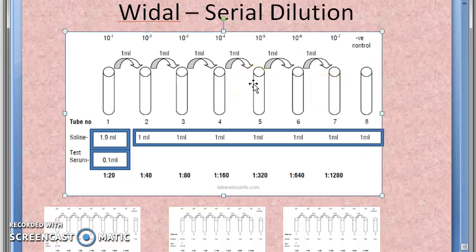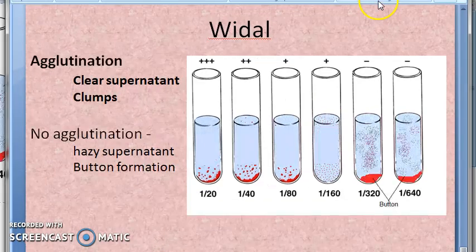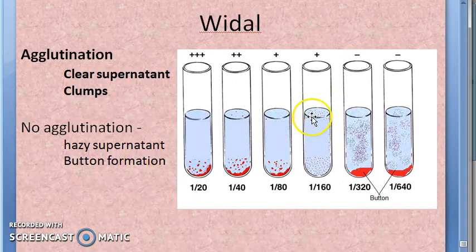This one we have done only for the Typhi O antigen. For Typhi H antigen, for Paratyphi A H antigen, and for Paratyphi B H antigen, you should do the same, so you need so many test tubes in total. Now we have left this at 37 degrees centigrade overnight. In the morning we got up, and we are seeing this.